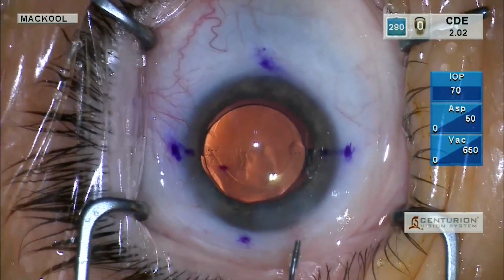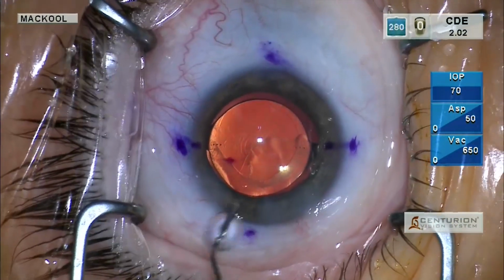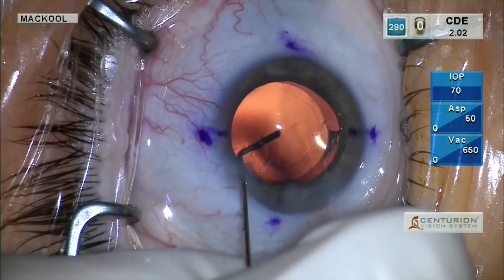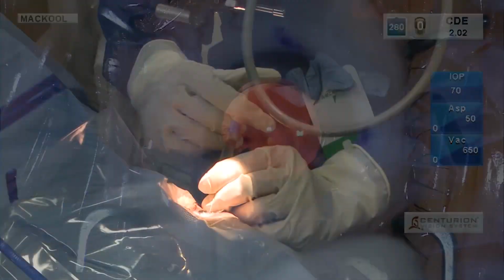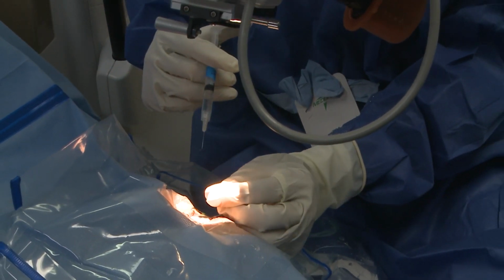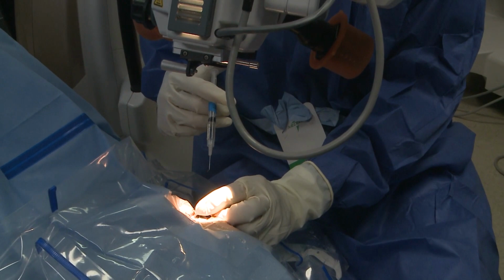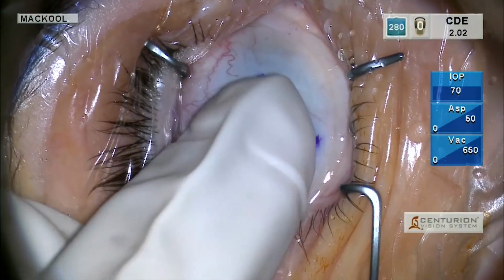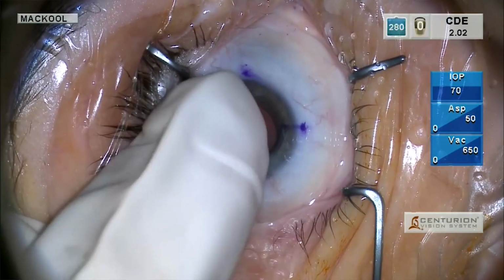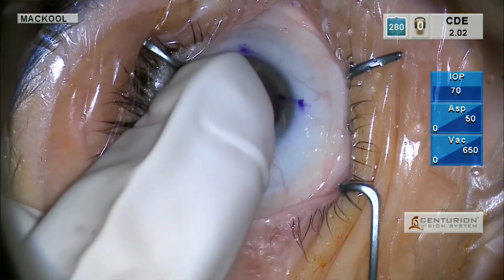And finally, we're going to go back and depress the intraocular lens fully into the capsular sac. It's there. That's good. It's aligned. IOP tested with a glove that's loose fitting, so I can actually feel the intraocular pressure. And if I do this several times, I can tell if it's changing, and it isn't significantly.